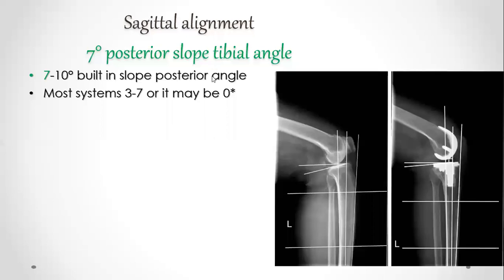Not only the slope, everything. You go and see it with another surgeon who is very expert with this company and how to deal with this. And after that, you make it, inshallah, successfully with your patient. It is very important to know that you can apply it by hand, all right?